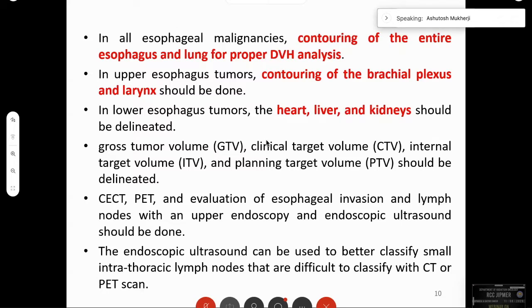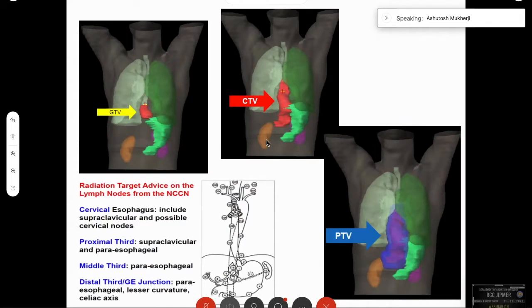The GTV, CTV, ITV, and PTV should be delineated. PET is used for planning. Endoscopic ultrasound can sometimes classify smaller intrathoracic lymph nodes better than PET. Traditionally, GTV will be something small, then the PTV goes all around in a regular contour.